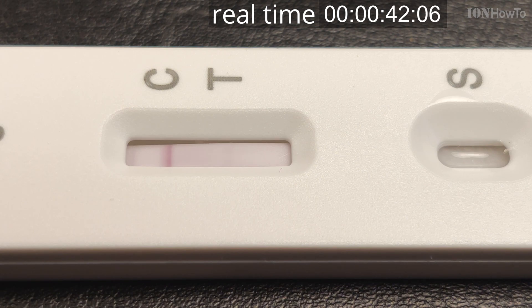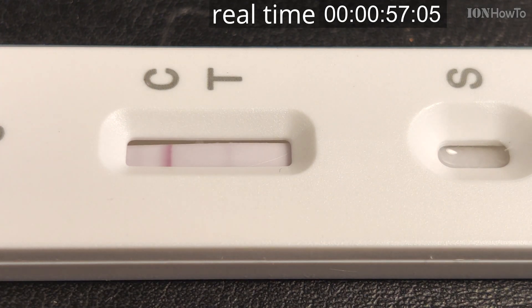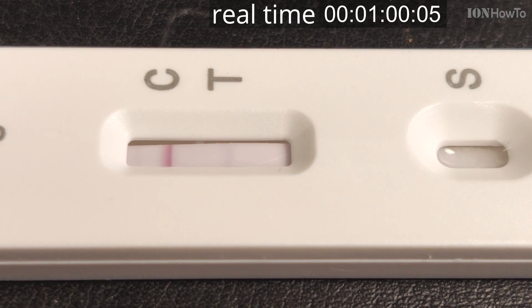These tests are meant to be read after 15 minutes. You put the sample on the S pad. If you have a line only on the C area, it's a negative test. But if you also have a line on the T area — even if it's faint — that's still a positive test. If you have only a line on the T area without a line on the C area, it's an invalid test. If you don't have any line, it's also invalid, and you can just repeat the test.